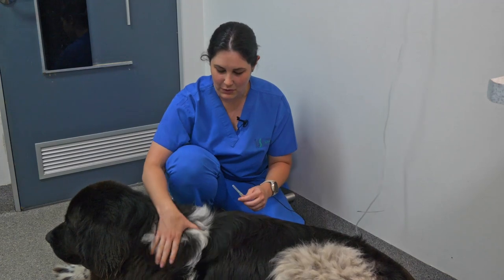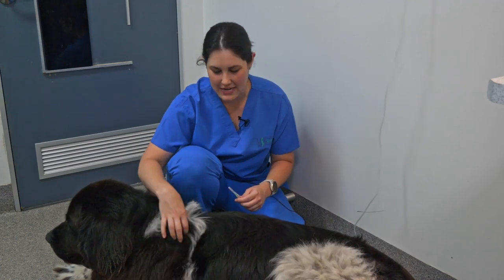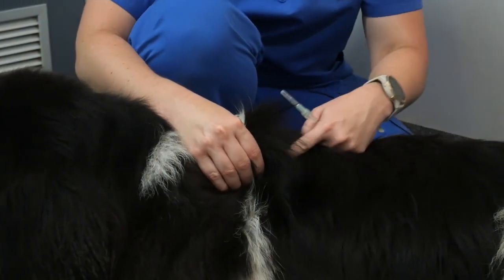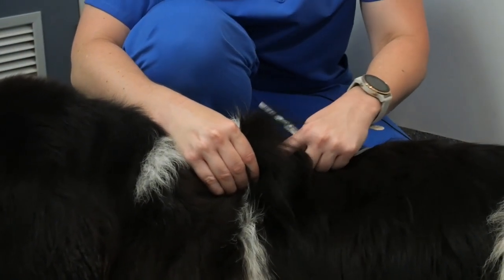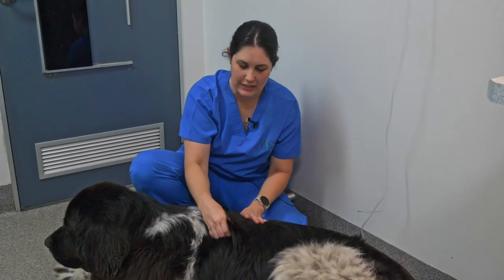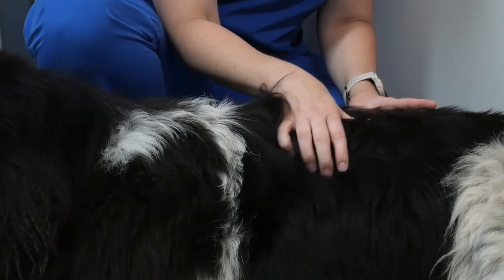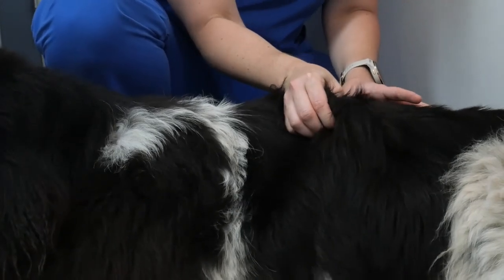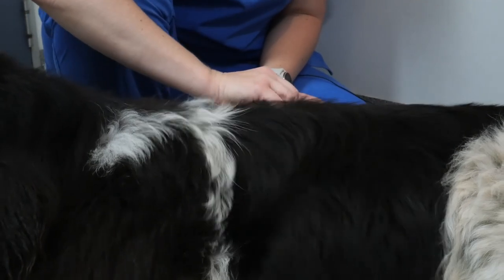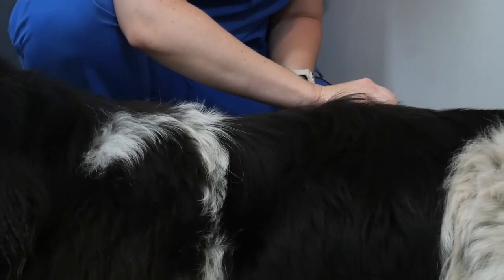Now we're going to show you how to prepare for the fluids. We want to find a nice loose piece of skin and tent that up. We want to form a little V and go right at the bottom of that V in the middle. When giving fluids at home, we don't always want to stay in the same spot. If we're doing this regularly or there's a large amount of fluids, we want to find different locations over our pet so we can distribute the fluid evenly through a larger portion of their body.